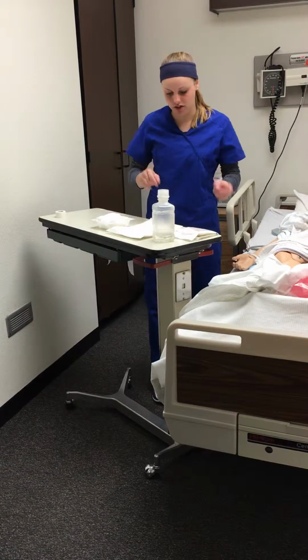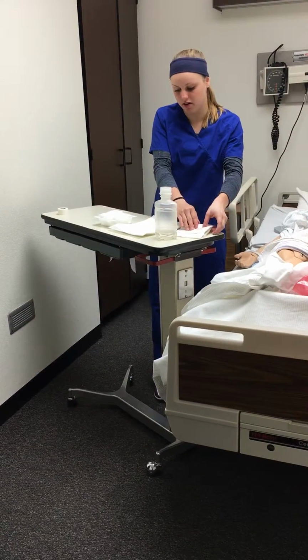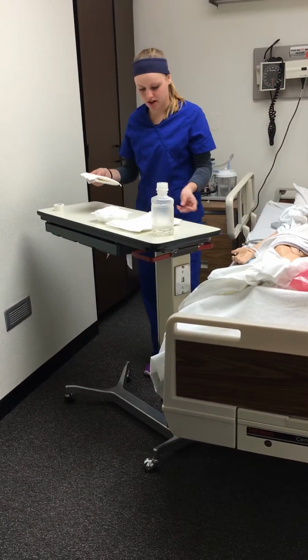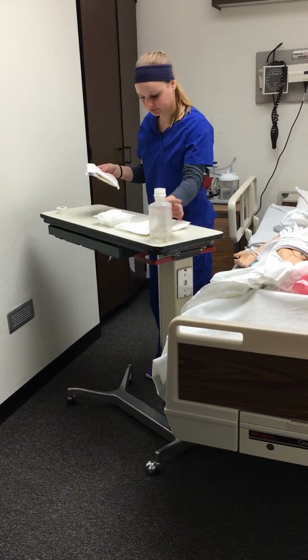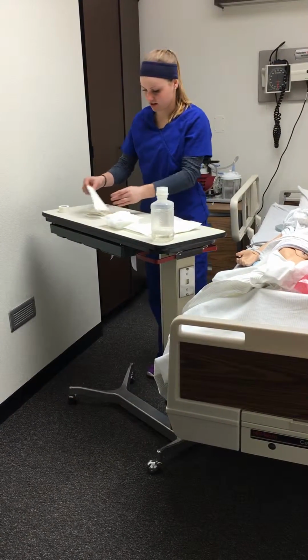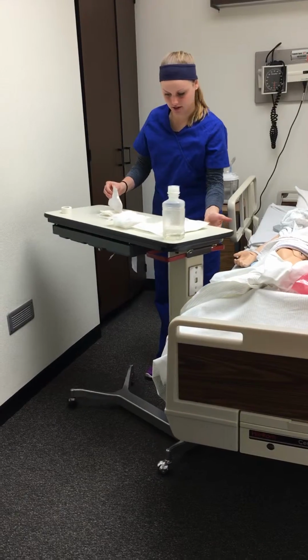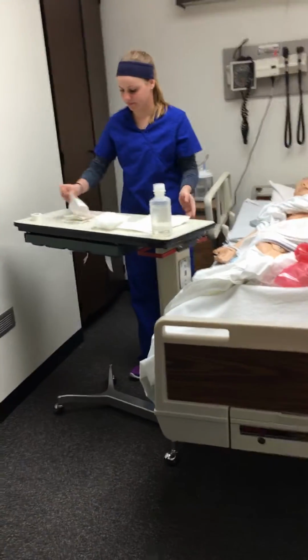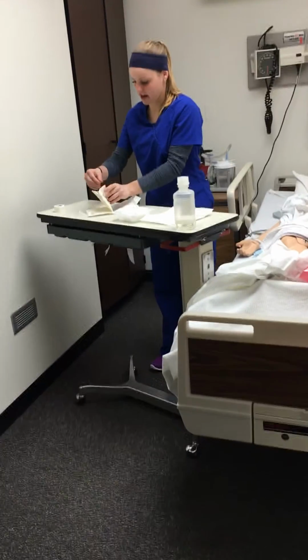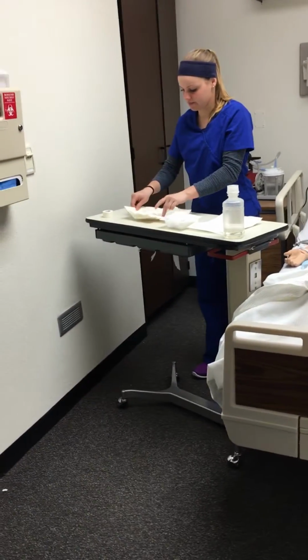So I'm going to establish my sterile field by taking my sterile gloves, and we're just going to pretend for the purpose of this that these are all separately wrapped in sterile containers. This is nice in front of me. Okay, we'll get our sterile gloves out.